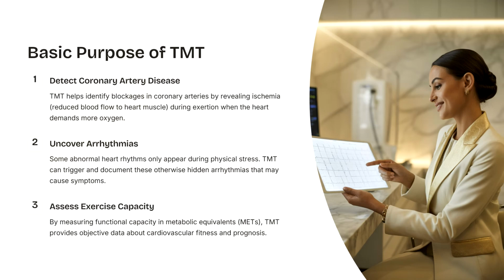Now we have to know what is the basic purpose of TMT, meaning why the doctors will prescribe the TMT and why a patient will go for a TMT. Number one, to detect coronary artery disease, meaning if there is any problem in the coronary artery. We all know about the coronary artery. It is the artery situated in the heart within the cardiovascular system. It helps to identify blockage in the coronary artery.